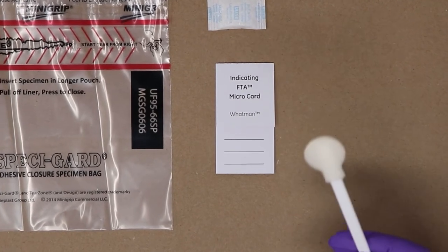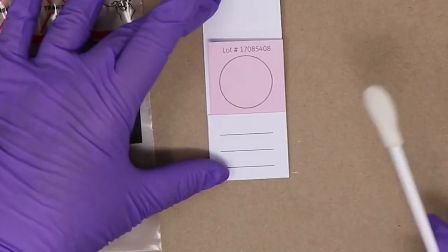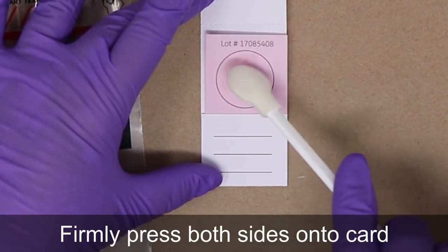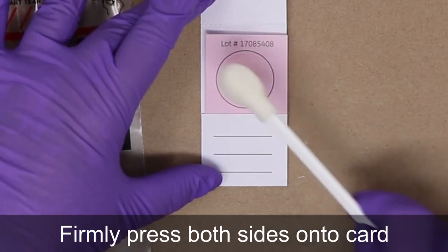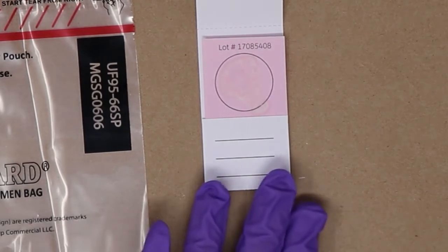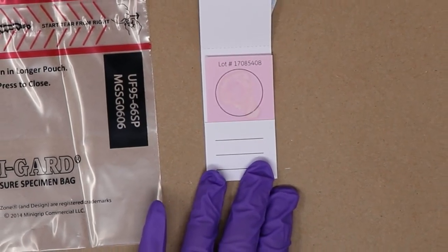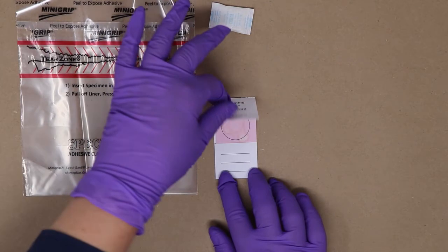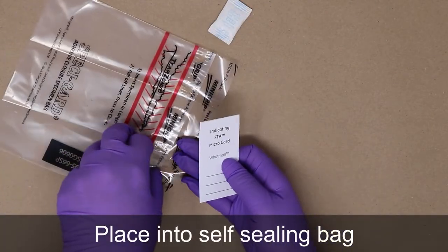The foam-tipped applicator is then pressed into the circle on the pink FTA card. Both sides should be pressed firmly onto the card. Once this has been done, a whitish color change can be seen on the pink FTA card. The card can then be placed into the self-sealing bag.